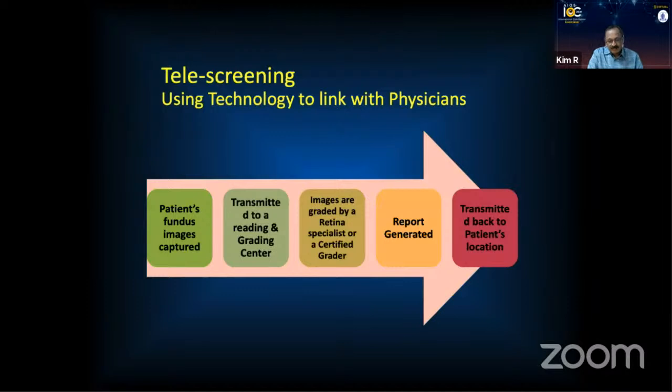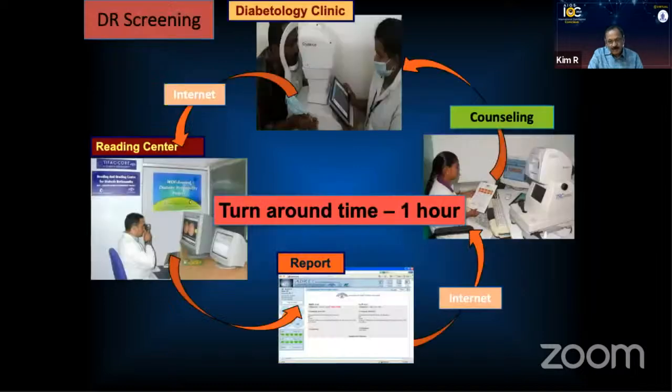So just for completion, I'm showing the process of tele-screening, where the fundus images are taken from a remote site, sent to a retina specialist, graded, and the report is sent back. We've been doing this for the last 2 decades.